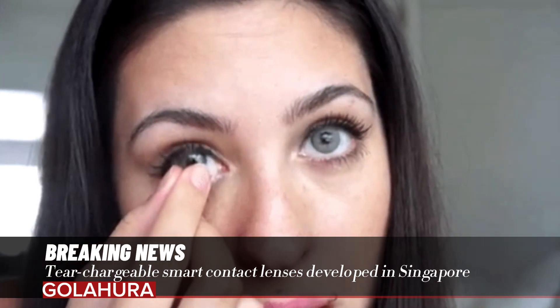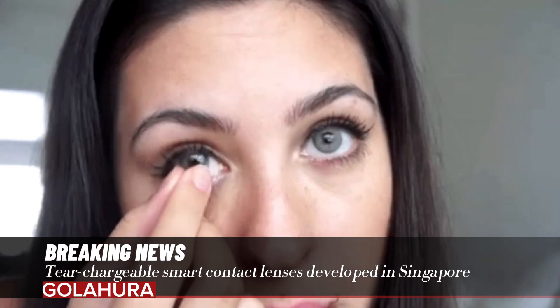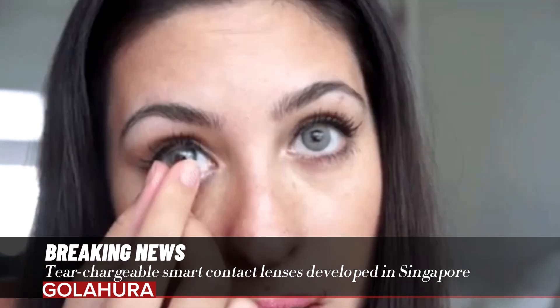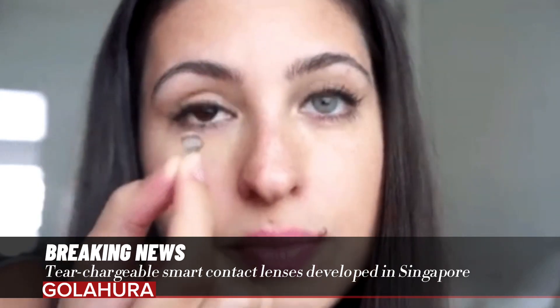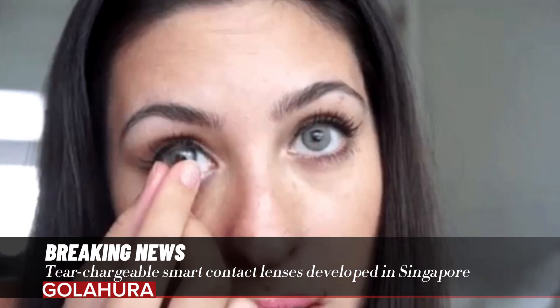The battery is made of biocompatible materials and has a glucose-based coating. This coating acts as a circuit to generate electricity by reacting with the sodium and chloride ions present in the water inside the battery. Since sodium and chloride ions are also present in tears, the lenses can practically charge while the wearer wears them.